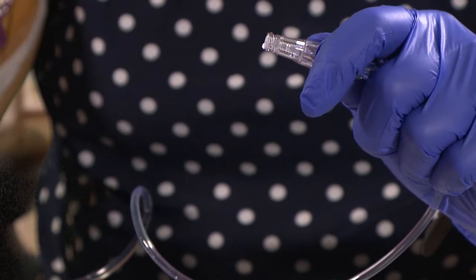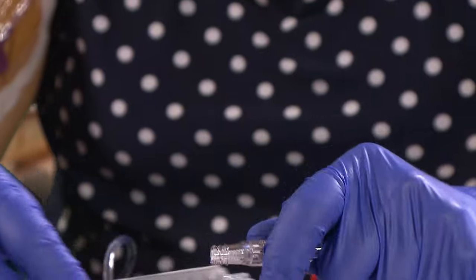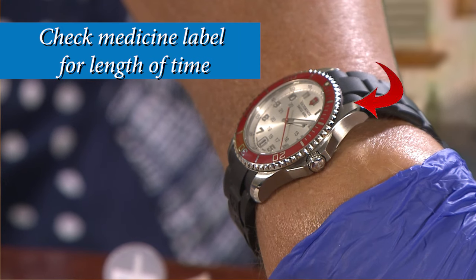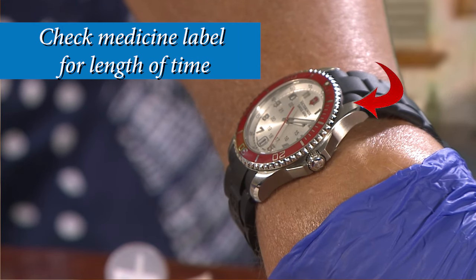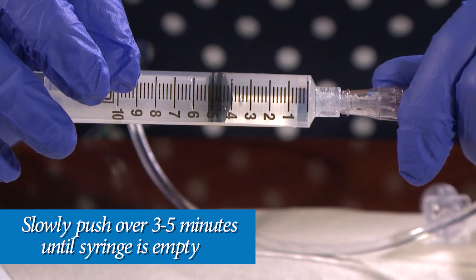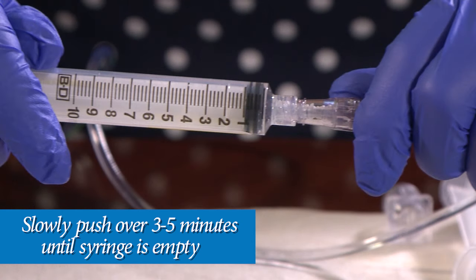Next, take the saline flush syringe off the PICC line extension by untwisting it. Then, twist the IV antibiotic syringe onto the PICC line extension. Now, get a watch, clock, or timer and review the amount of time shown on the IV antibiotic syringe instructions. You will slowly push your IV antibiotic into your PICC line extension over the number of minutes shown on your instructions.